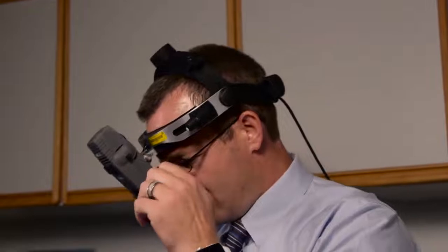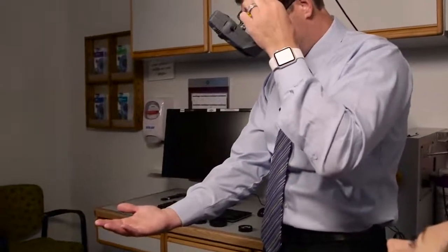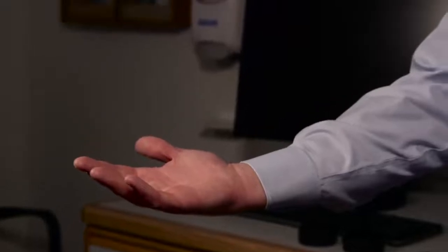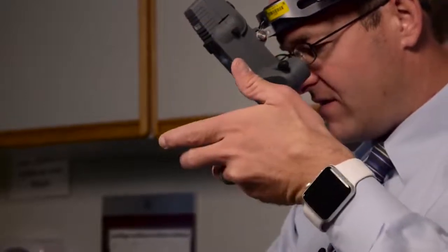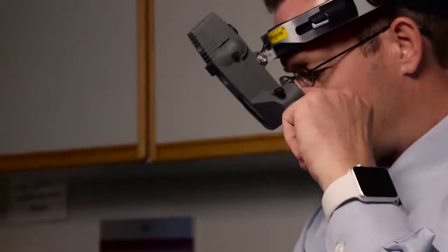And then there's a knob here on the left that turns the beam on and off. Okay? You want to turn the beam on. Bring the piece here so it's just touching your nose. That generally ends up being about the right location. Not that it's smushing it, but it's just touching your nose. That way the horizontal position is located correctly in relationship to your eyes.